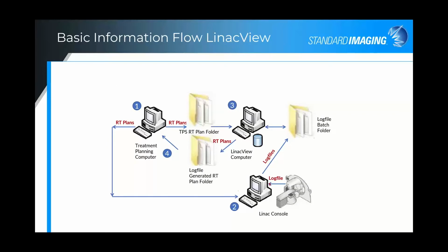So here's the basic workflow for LinacView. Everything begins with the RT plan. The RT plan is exported from the treatment planning computer, both to the Linac console and as well to an RT plan folder. This RT plan folder is then monitored by LinacView, and those RT plans are imported and waiting to connect those RT plans to log files that come through the Linac.